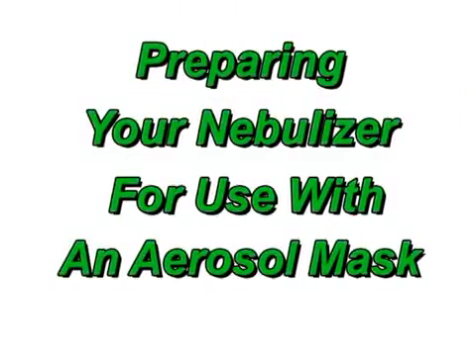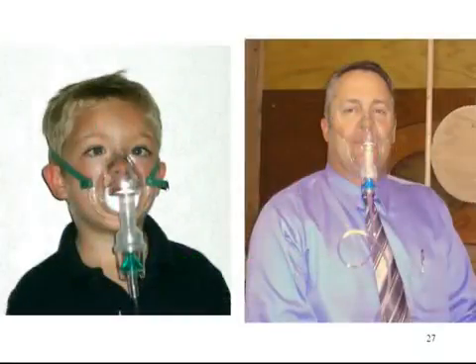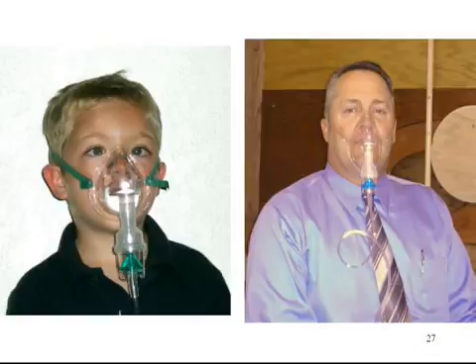Both adult and pediatric style Salter aerosol delivery masks are available separately from your healthcare supplier. These attach in place of a mouthpiece, T adapter, and corrugated tube to the handheld nebulizer. With small children, an adult should always supervise the setup and use of the compressor and the nebulizer.